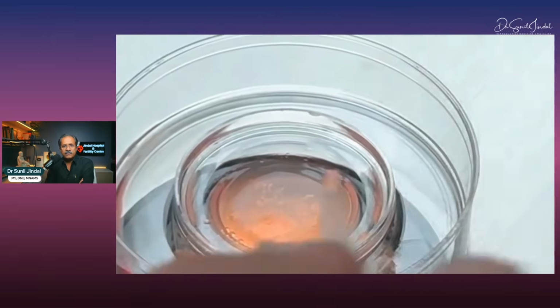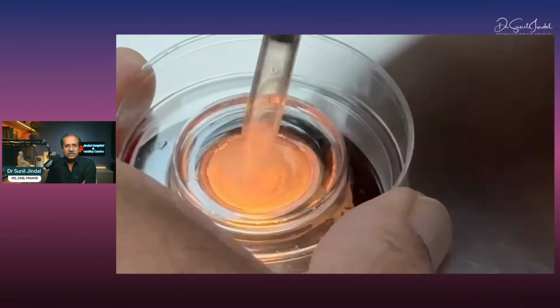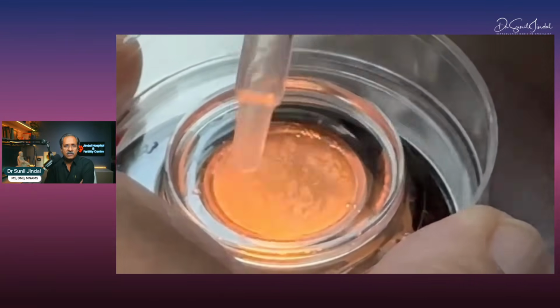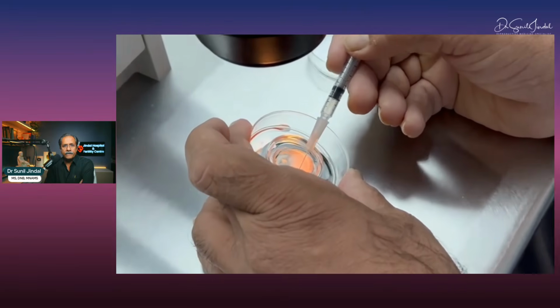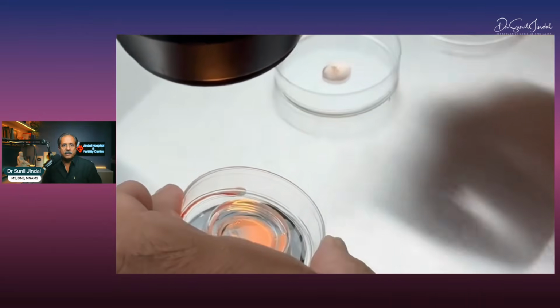And after we have done that, we would take out, and this is another thing which we normally do with the syringe end, so that we could squeeze out every sperm which may be present in this particular tissue. Once this is done, then we are clear we need to take it under a microscope.